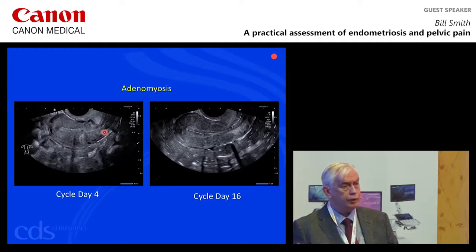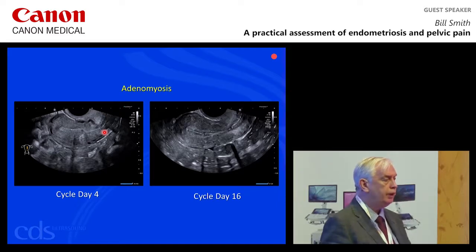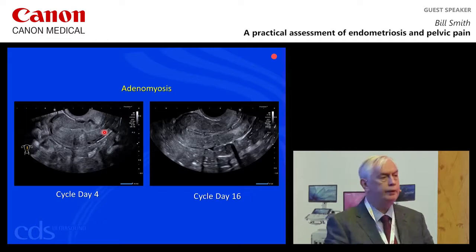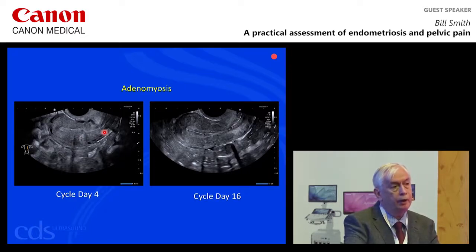So if we're unsure, we were doing more and more work in this situation. Very important to have the same settings, the same machine. But if you're trying to differentiate between diffuse fibroid disease, inflammatory changes, or adenomyosis, if you look at the glandular changes, the myometrial changes around a period, you would expect changes.